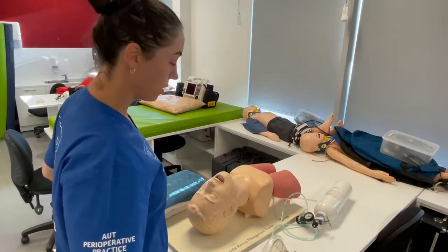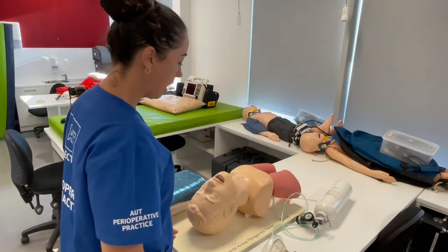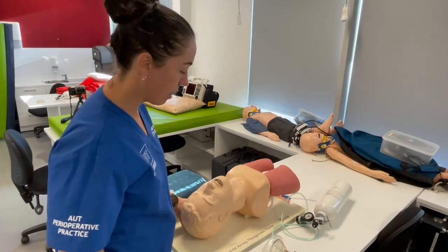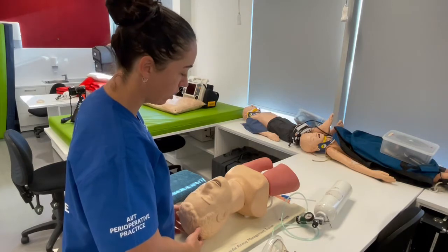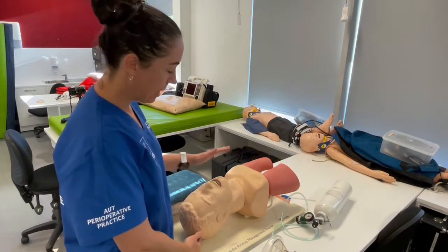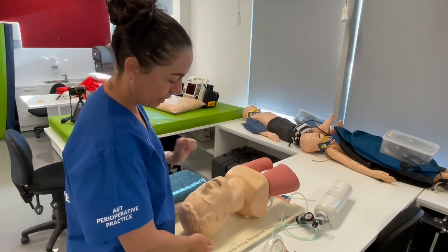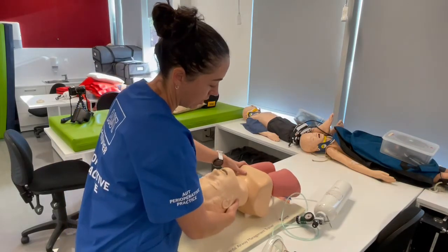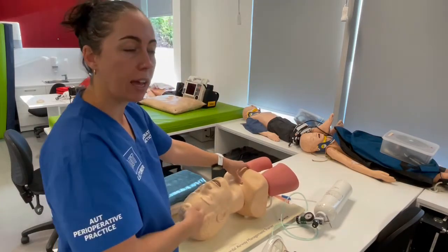Kia ora students. I'm going to run you through all of the crucial airway skills. The first one is positioning — achieving the sniffing position for your patient, which is neck flexion and head extension.